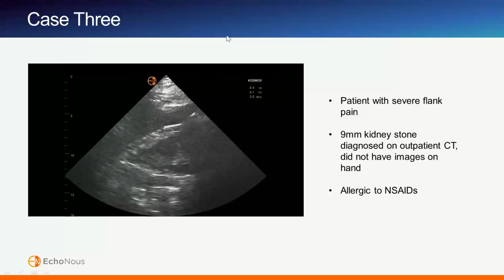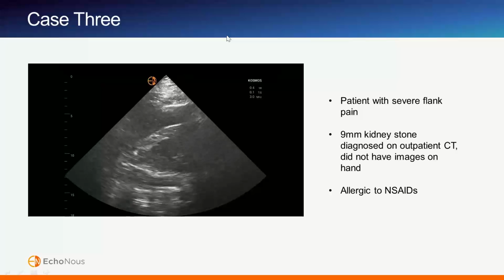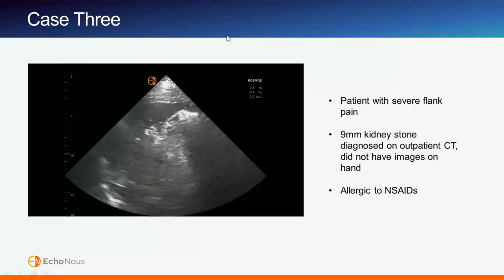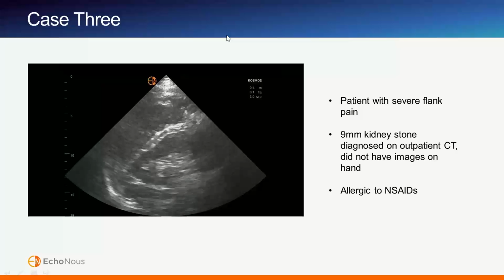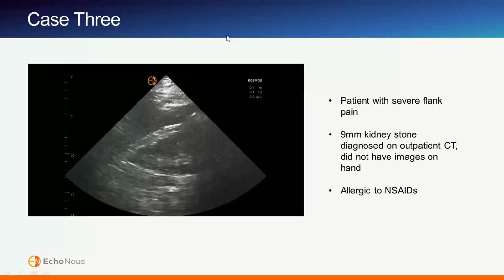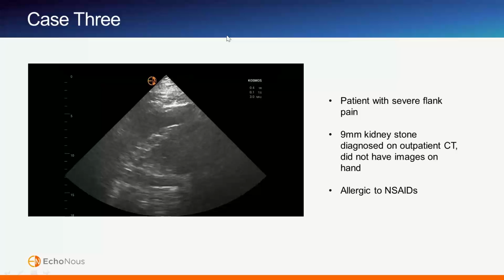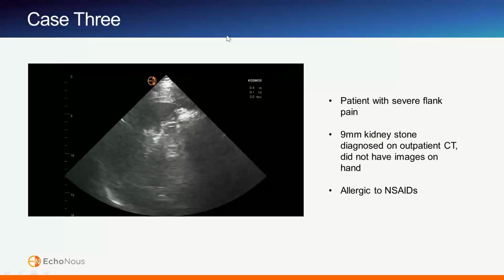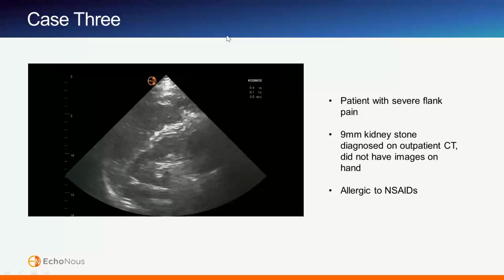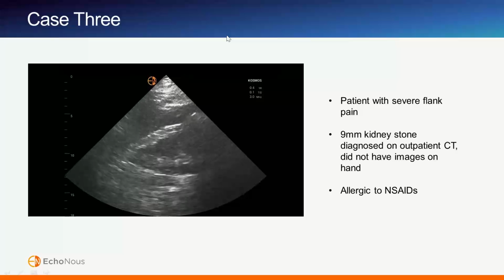Yeah, I like that. And I like thinking about it as, ultrasound in this case got this patient seen and evaluated quickly. A lot of these patients aren't going to be in the ED for as long because they don't necessarily need the CT. Your patients who you might CT would be the ones who are older, first-time presentation of stones, multiple comorbidities, fevers, chills, severe hydro. Those are patients who you're probably going to err on the side of CT, but many of our patients are well-appearing, young, history of stones, not infected appearing, pain's well controlled, and you can actually diagnose these patients at the bedside with signs or stigmata of kidney stones. So don't forget to take a look at the bladder, because sometimes you can see the stone there as well.